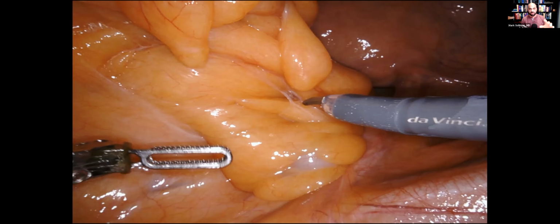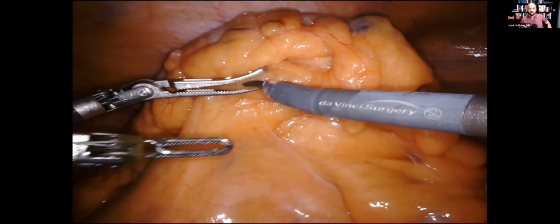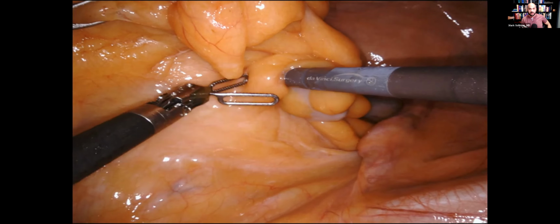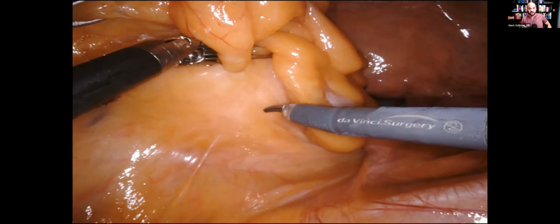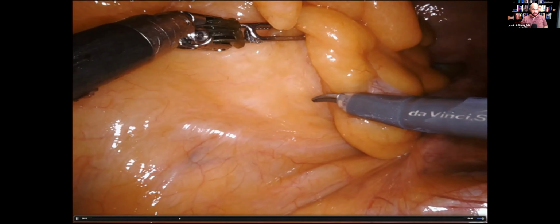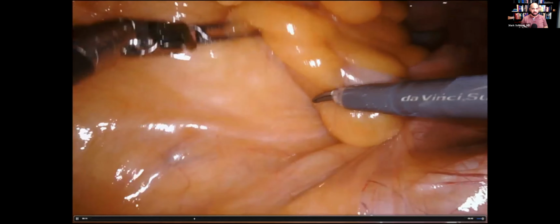But once you, doc, get all these adhesions taken down, make sure you restore the anatomy to something that looks more normal and then get started. So that's where we're going to pick up this video. Tip up is holding the mesocolon up like that. I'm going to identify basically where the junction of the mesocolon and the retroperitoneum exists. And I'm going to pause the video right here.